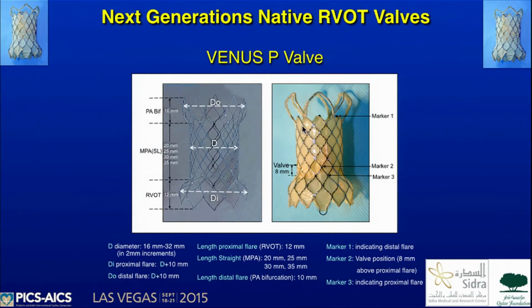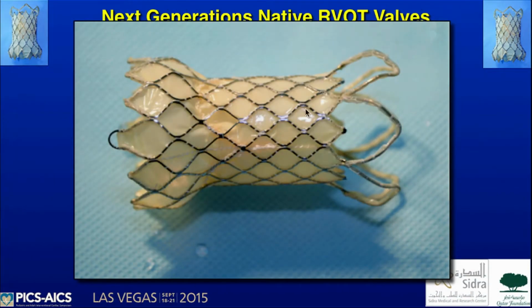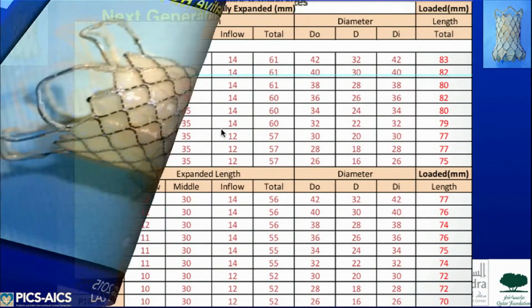And this is the valve as it stands. So these are the distal cells that are uncovered by the pericardium. And this is another view. So this part here will be anchored towards the bifurcation. This is towards the inflow, and this is the straight part of the bioprosthesis where the valve is.